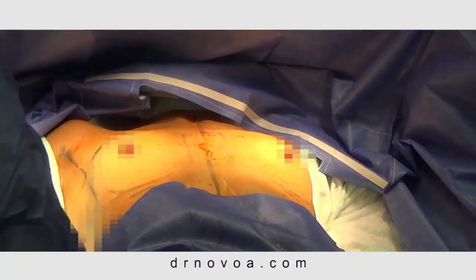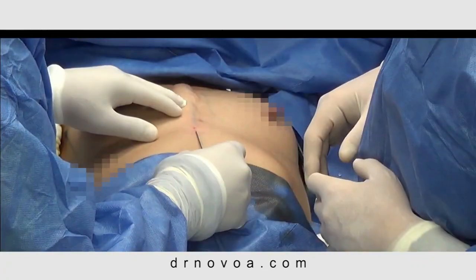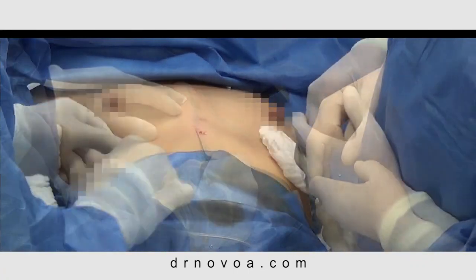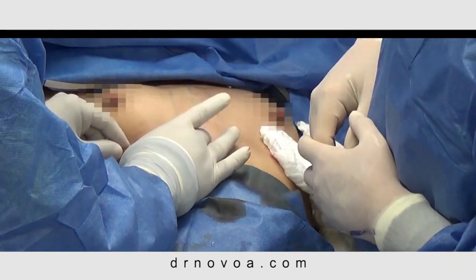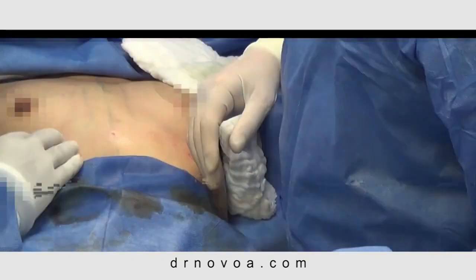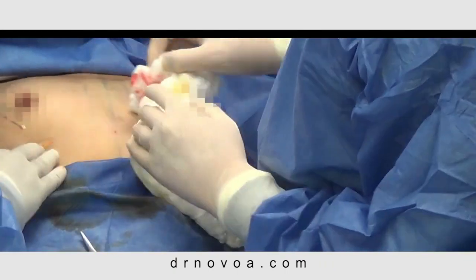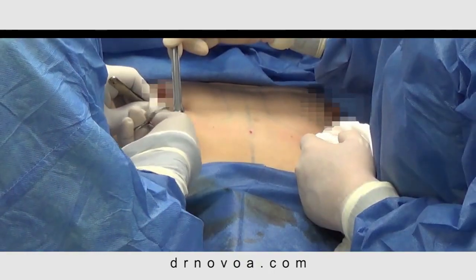Surgery begins with infiltration of area 1, the mid-sternal line, from the xiphoid process to the second rib, moving on to area 2 of each breast, along the inframammary crease up to the nipple areolar complex. Then area 3, 4, and 5, infiltrating tumescent lidocaine in the space created between the pectoralis muscles and the intercostals on each side. The initial incision is made in the inframammary crease.